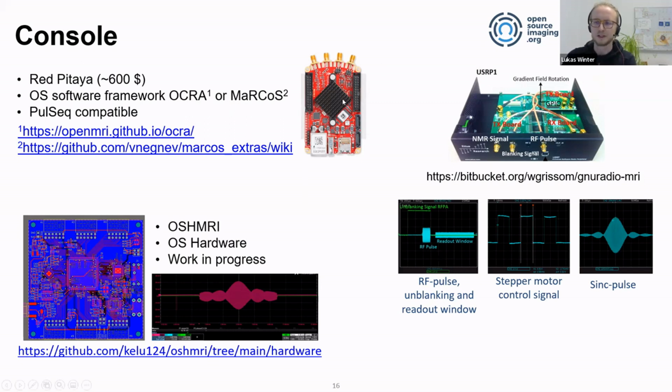They all have an FPGA, and they have some RF transmission and reception channels, and can be used basically for the MR application. And this works pretty well. These designs are not open source. On top, this Red Pitaya, for example, is not an open source hardware design, but in parallel, there's also some work ongoing to actually have some dedicated open source hardware for this MR application, like here on the bottom left. So things are being done in parallel to be used in the future.